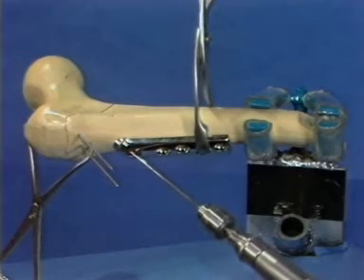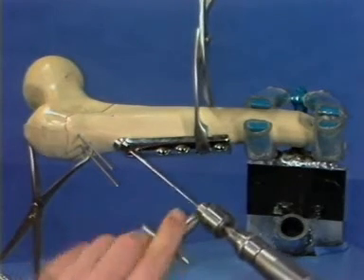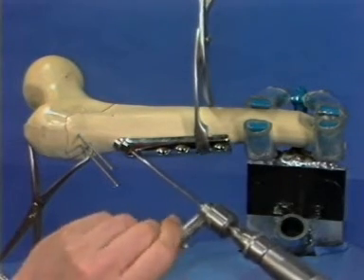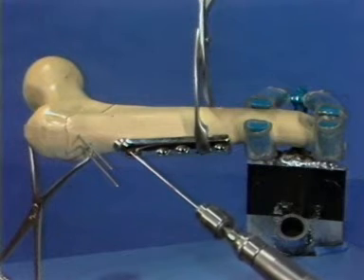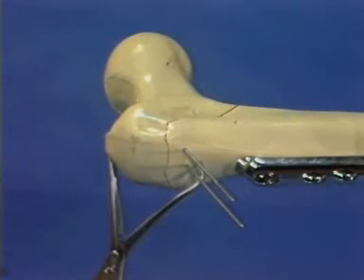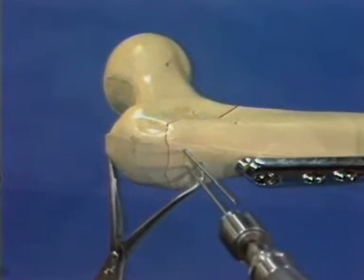Using the small drill, the guide pin is removed by turning in a counter-clockwise direction. The two provisional Kirschner wires are likewise removed.